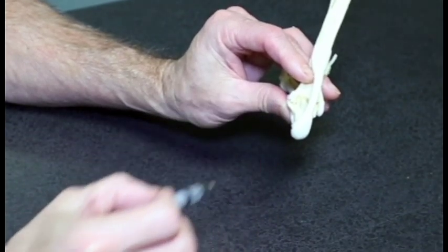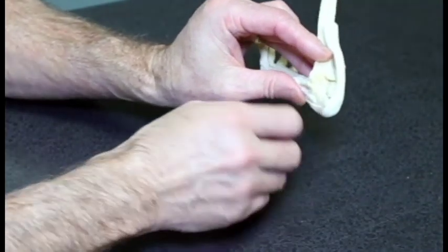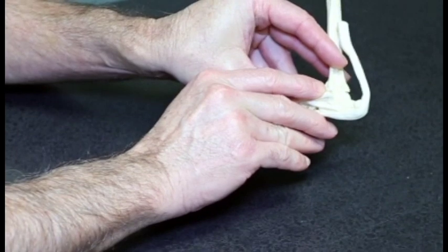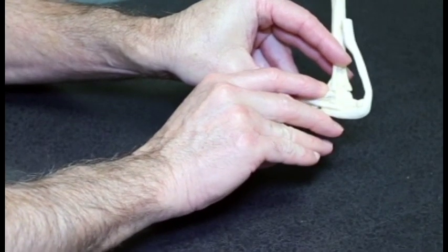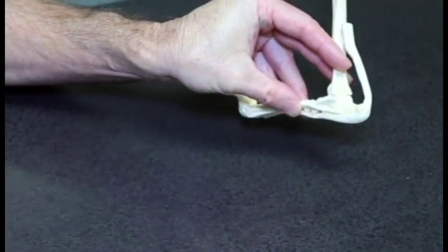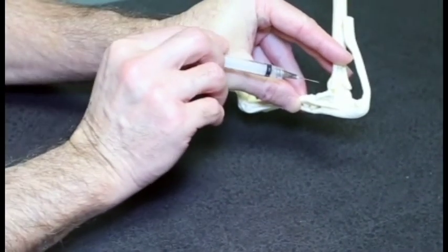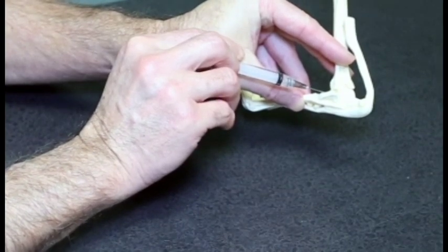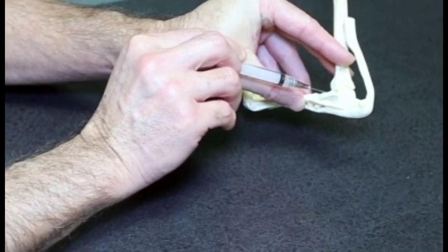Another approach is from the cranial lateral aspect. Slightly flex the joint and palpate the cranial space between the tibia and tibial tarsal bone. Drag the needle in a medial direction, and again this joint is shallow so you don't need very much penetration.